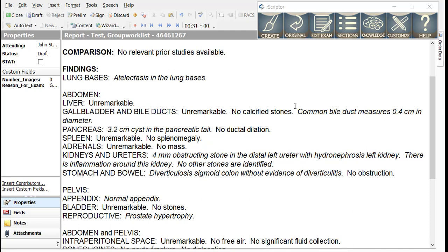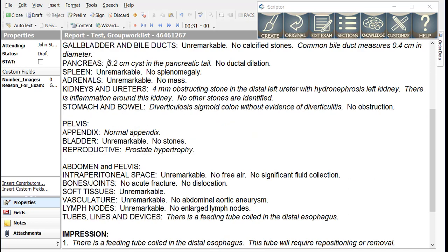We can see in this report that the common bile duct statement was placed into the gallbladder and bile duct section of the report.